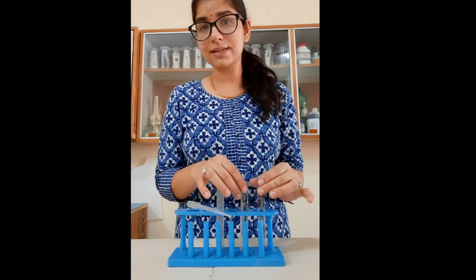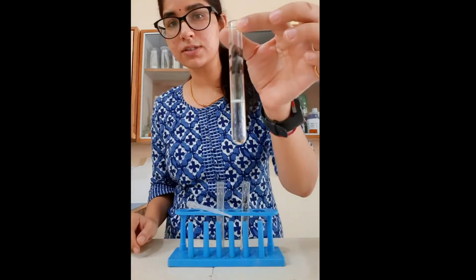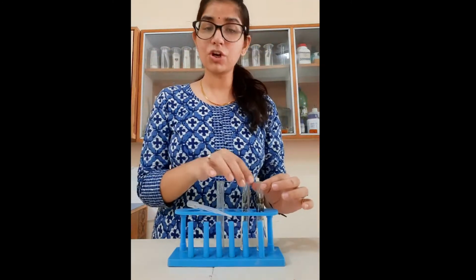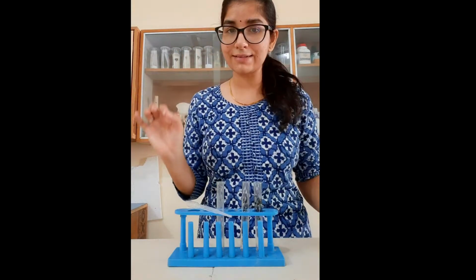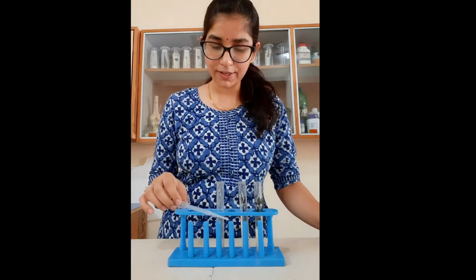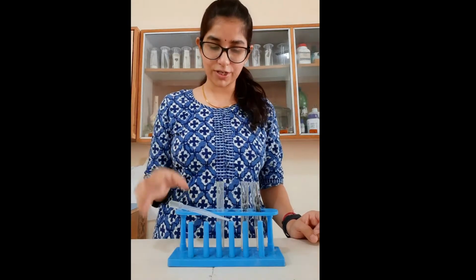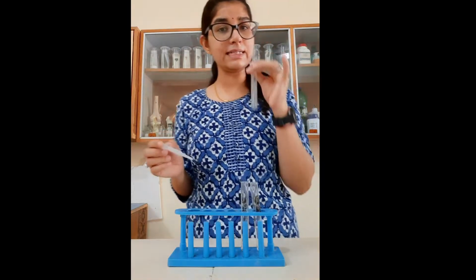because we are going to perform Heller's test, we need concentrated nitric acid. So in this test tube I have taken concentrated nitric acid, and I have labeled it properly that this is my concentrated nitric acid. So it should be clear with your test tubes what you are going to perform. So we are going to perform Heller's test, and here I have taken 3 test tubes and 1 dropper. One test tube is for my experiment, and one is with the urine sample and one is with the concentrated nitric acid.